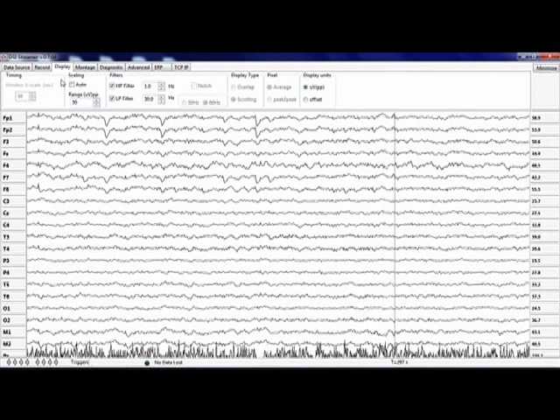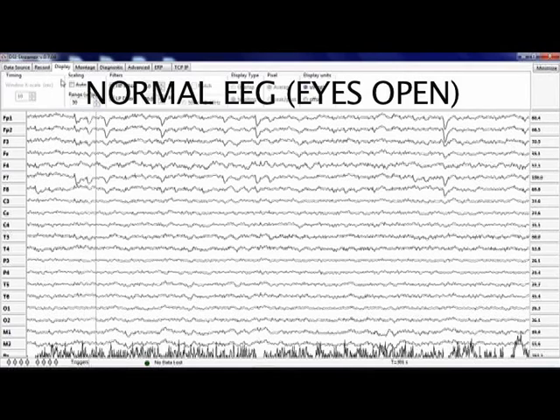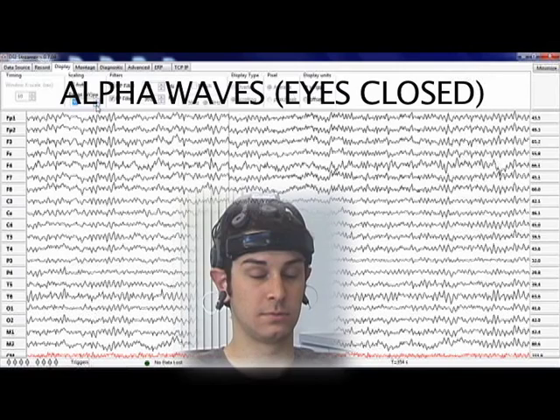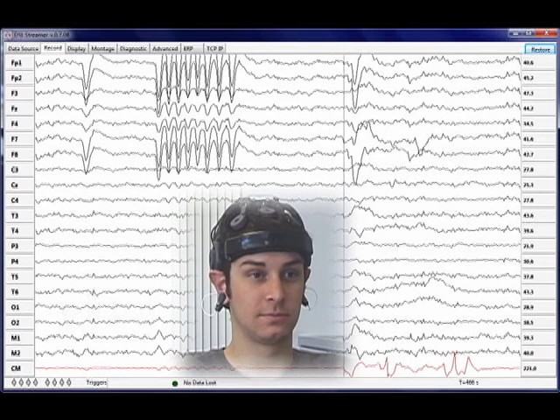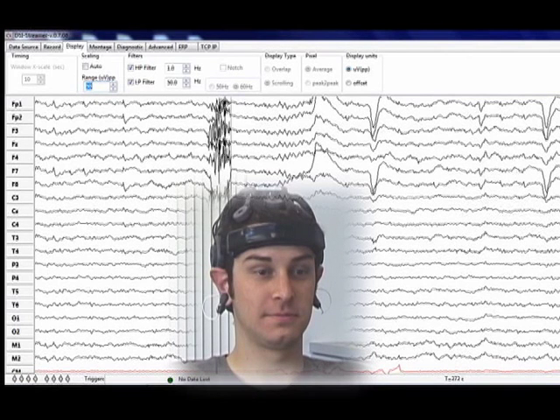Here is a sample of a typical eyes-open EEG signal. Here is a sample of a typical eyes-closed EEG signal showing alpha activity. Here, the subject does a series of rapid blinks. Here we see EMG activity due to the subject clenching his jaw.